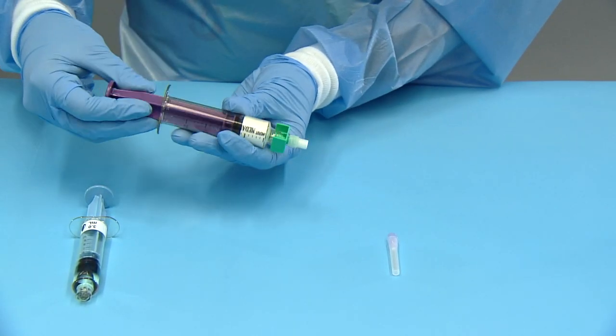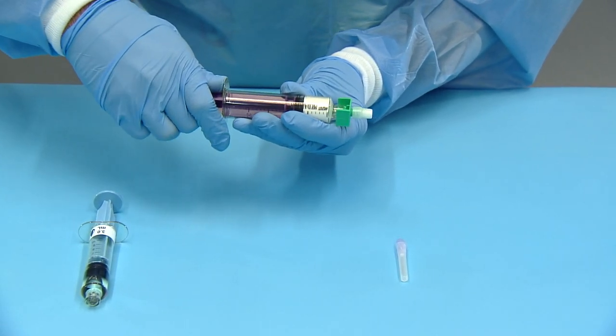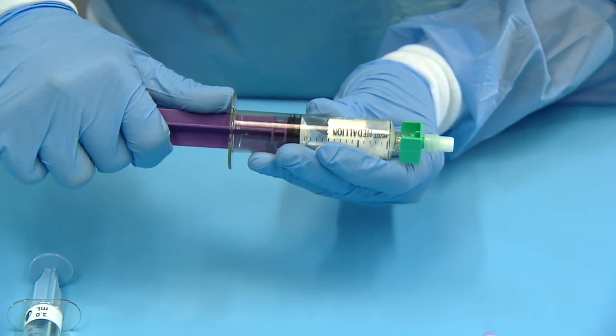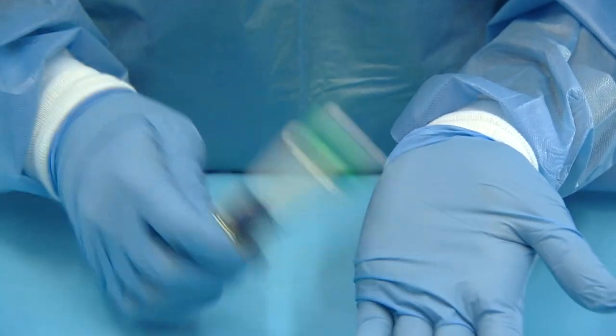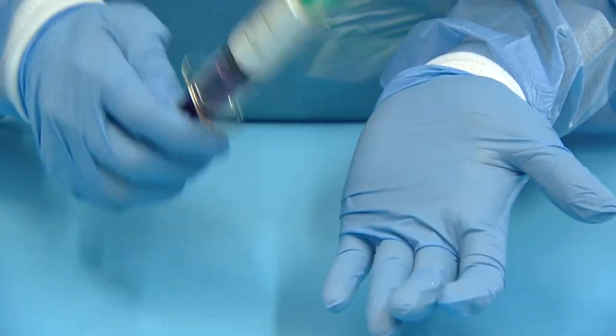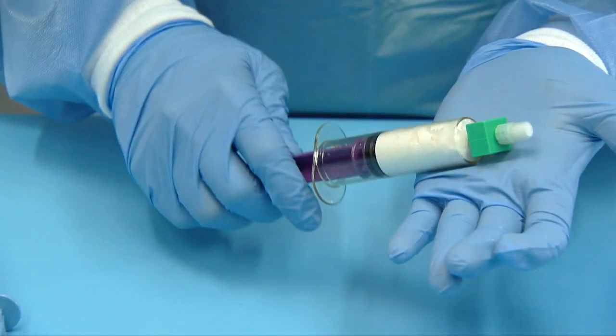Pull back the plunger of the powder syringe to aspirate approximately one cc of air. Hold the powder syringe vertically with green connector on top and tap the side of the powder syringe near its tip sharply four to five times with a hard tool or against a hard surface to loosen the powder.